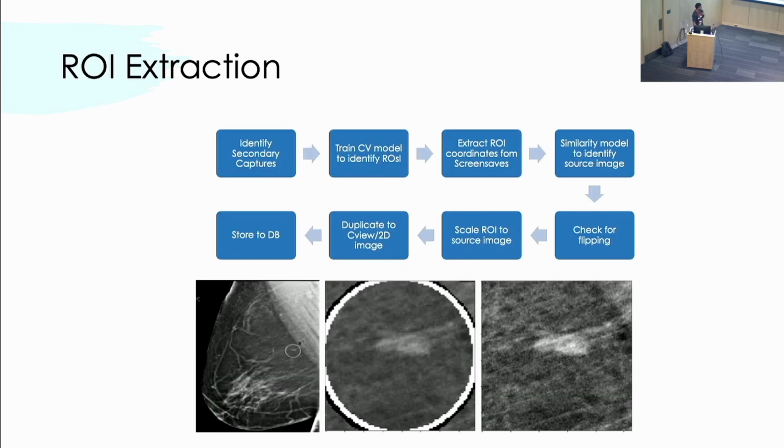Okay. The other thing, I talked about ROIs earlier. It was a huge pain in the butt to get these, but it's worth it because we have 40,000 ROIs. So this is a screening study. The radiologist saw something. They drew a big circle on it that got hard-coded into the image instead of saved as a DICOM object, which was very bad.